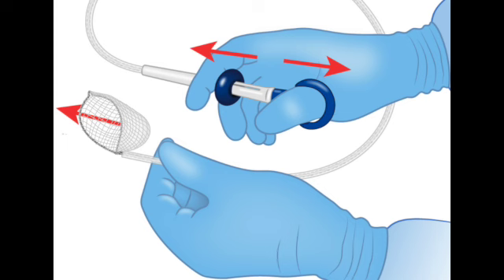Wow. Okay, we've really unpacked a lot today. We've mapped out those two distinct pathways for getting tissue samples from inside the colon to the lab bench. So now you know about the suction and polyp trap system for the little guys, keeping them identified, and the careful teamwork needed for the retrieval net when dealing with larger specimens. Yeah, and we've seen it takes this whole range of tools and techniques, doesn't it? From the quite sophisticated, like the multi-chamber trap, down to the surprisingly simple, like the toothpick and the cardboard. Each step, each tool plays a part in turning what the endoscopist removes into something truly useful, something actionable for diagnosis and patient care. Every detail matters. That sums it up perfectly.